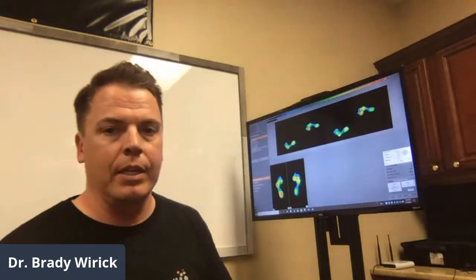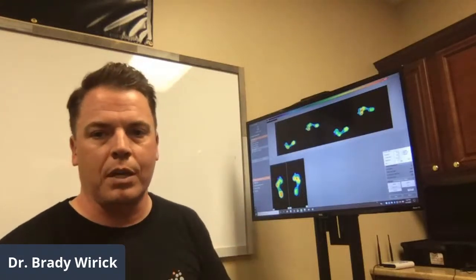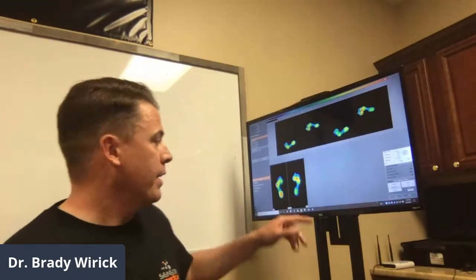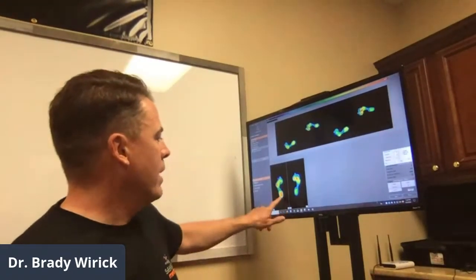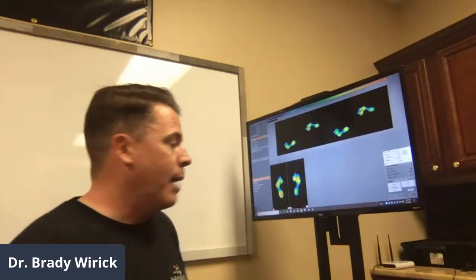We have the ability to measure each joint in its range of motion, as well as look at balance, which is huge. But in her particular case, her right hip is a big issue as she walks. I can see already that she's putting abnormal pressure on the outside of the opposite foot, which will throw that whole gait off. So we're going to create a custom orthotic just for her that's going to help balance some of that out.